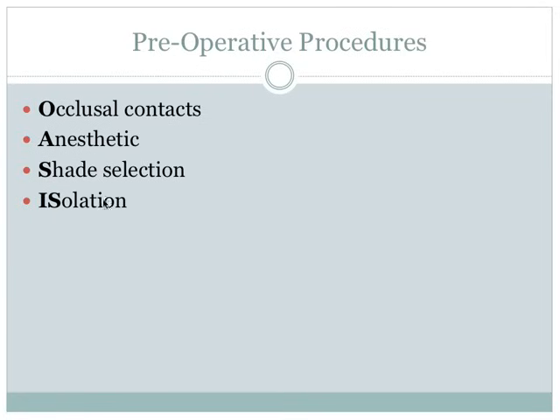And then lastly, you can use a rubber dam or use cotton roll isolation or an isovac to isolate the area that you're working with.